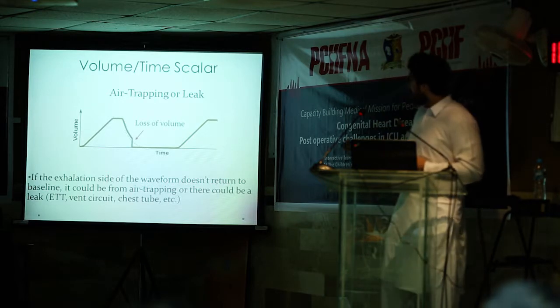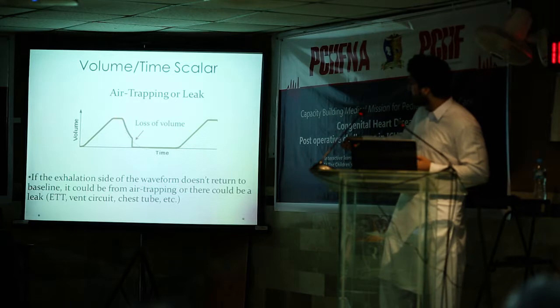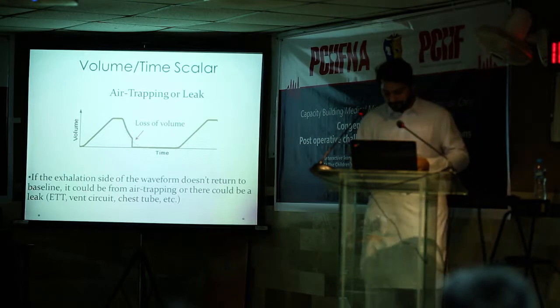From the volume, it is also the same as flow. It should come back to the baseline like this here. But if it doesn't come back to the baseline, that means there is air trapping.